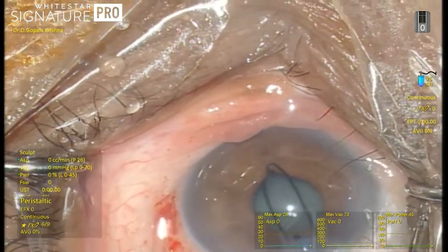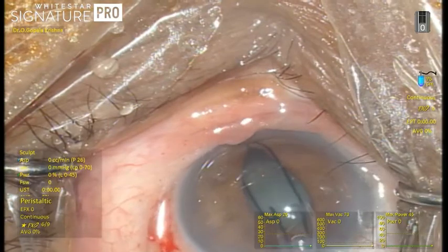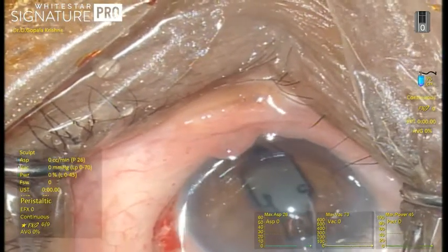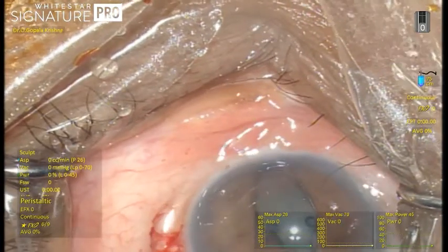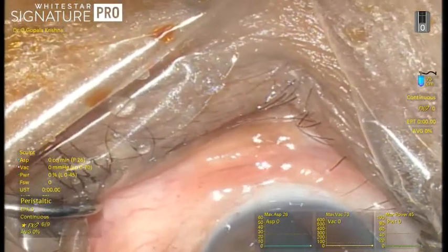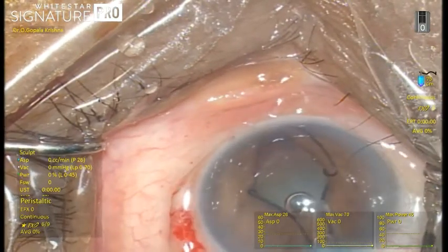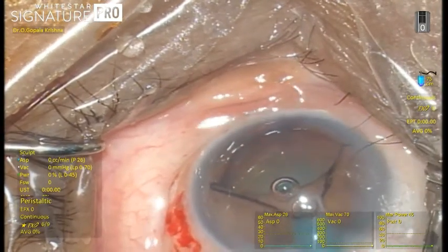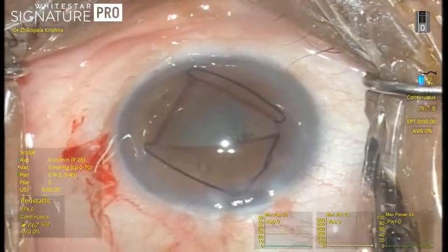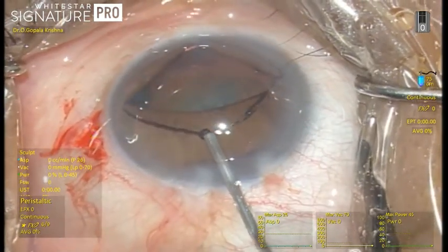The leading edge catches the pupillary margin away from the insertion site and you keep on injecting. The two side scrolls slowly open up and are wide open so that they easily catch the pupillary margins very comfortably without any hazard. Then you finish off the injection of the trailing edge of the pupillary expander ring.